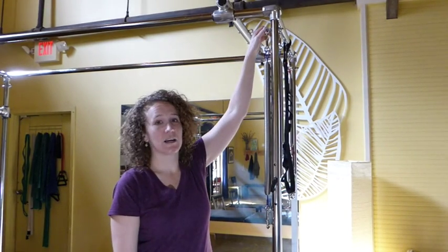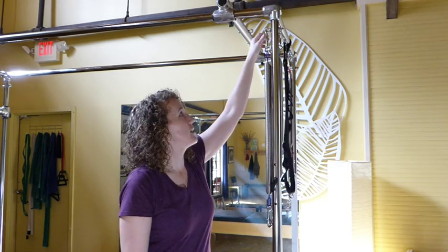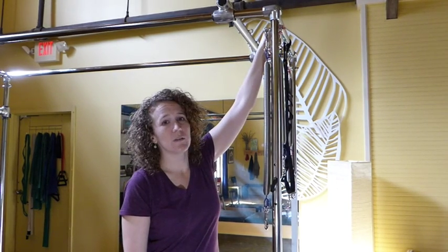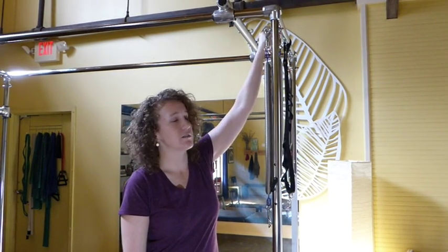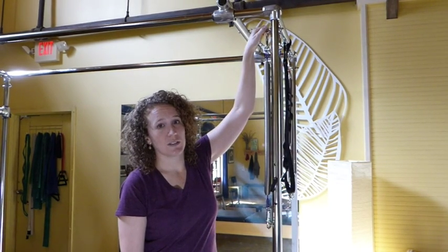When you look at your Cadillac, you want to check with your hands that all of the eye bolts are tight. As you go around, if you can wiggle them, then they need to be tightened. You can see this one is loose, so let's go ahead and tighten it.